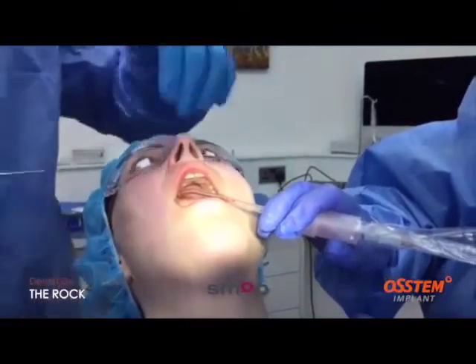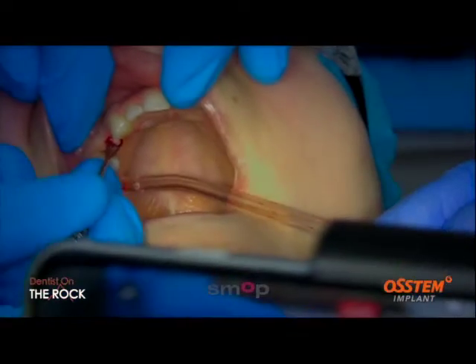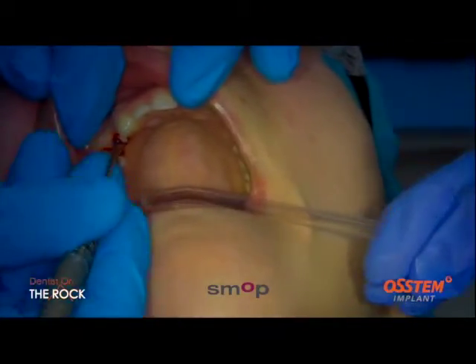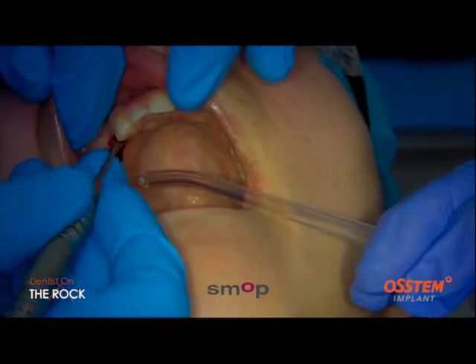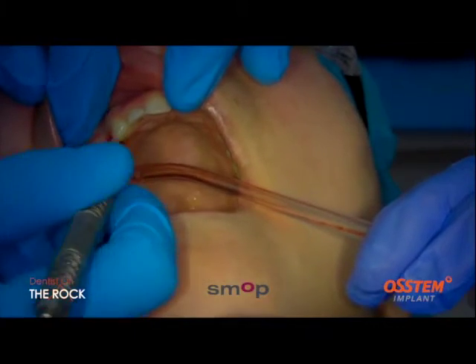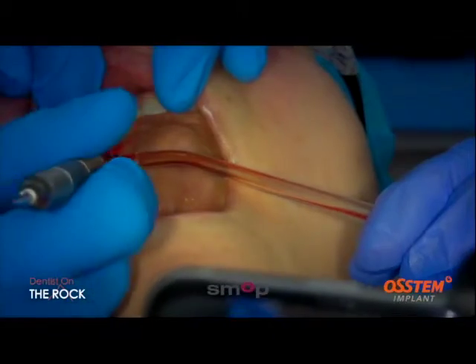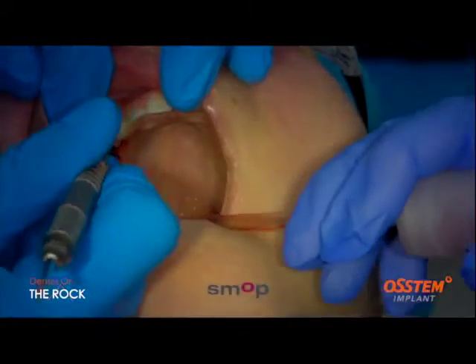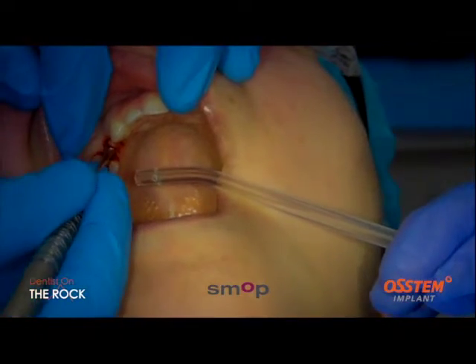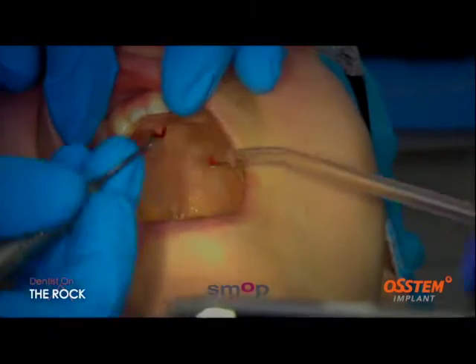Okay, so the next stage, you're going to remove this little soft tissue coating. So all I'm doing is I'm gently scooping underneath where that soft tissue punch is cut through. Now, like I said, the crest isn't completely flat, and so because it's not completely flat, you'll still have a little bit of attachment around the edges. So it's pushing that, but again, I'm using a tissue finger rest to support that action, okay, and then it just pops away. Now I'm going to pop this in some saline.